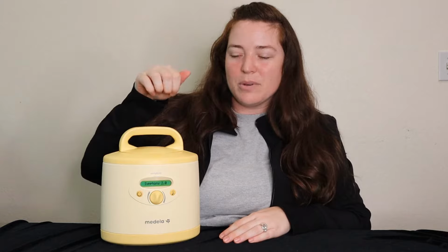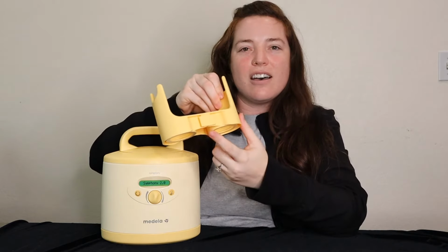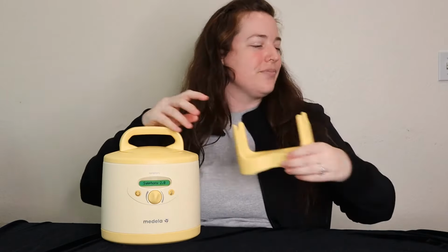Hey guys, I'm here to show you how to use your Medela Symphony hospital grade pump. In your kit, it'll come with the pump itself, a power cord, and then also a bottle caddy. This just slides on the back of the pump so you can carry your bottles around a little easier.